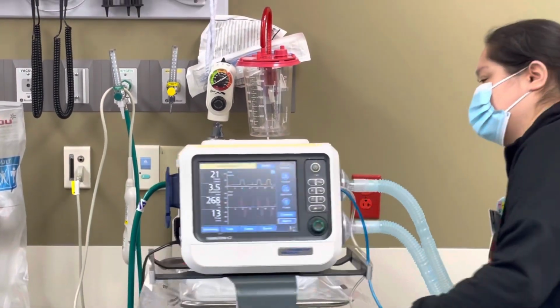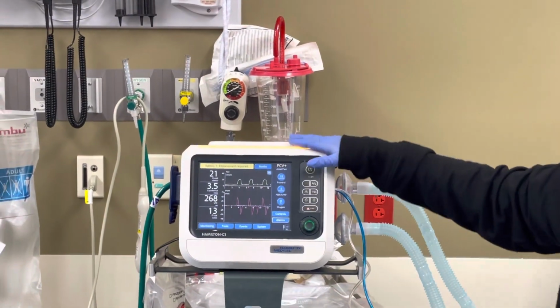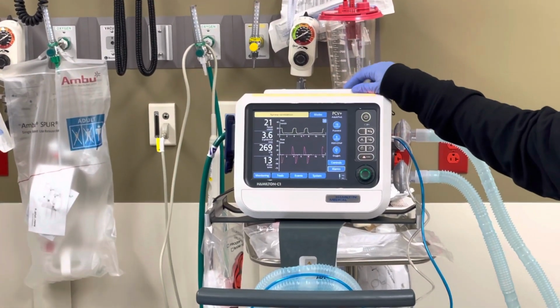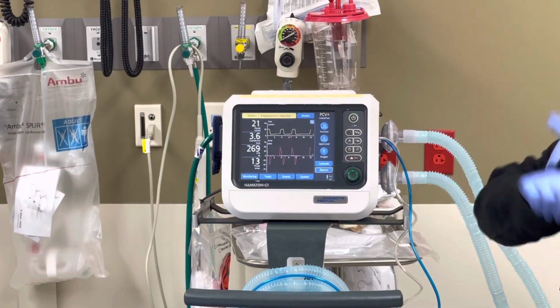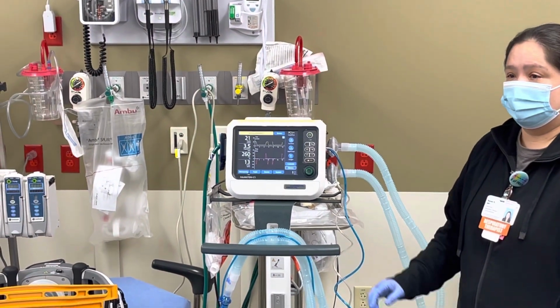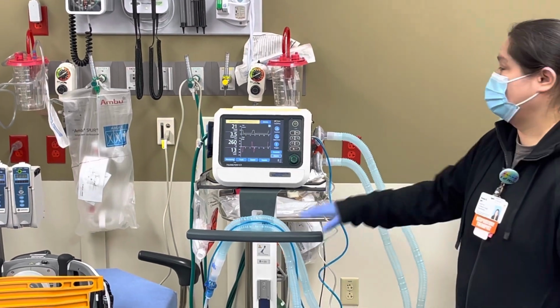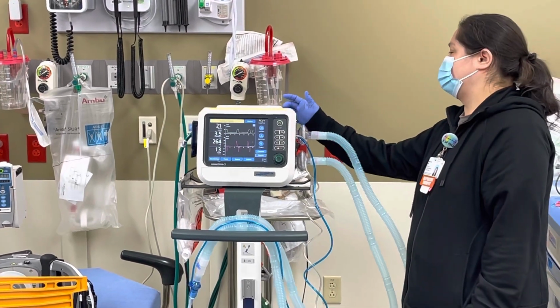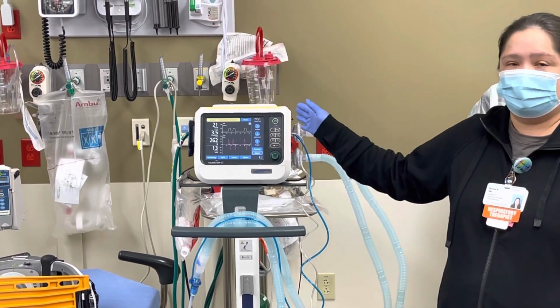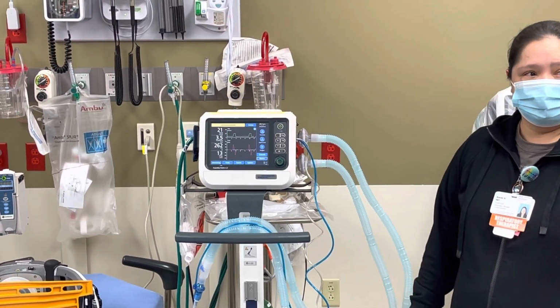Oh, this one actually does not belong to us. It's a rental, so what I need to do is reach out to Horatio at Peak, and he'll have to come out and get it, and I'll see if he has one he can swap out. Is that like yours? Yeah, we have these too, but this one just happens to belong to Peak. That's probably why, if you were calling biomed, they can't touch this.